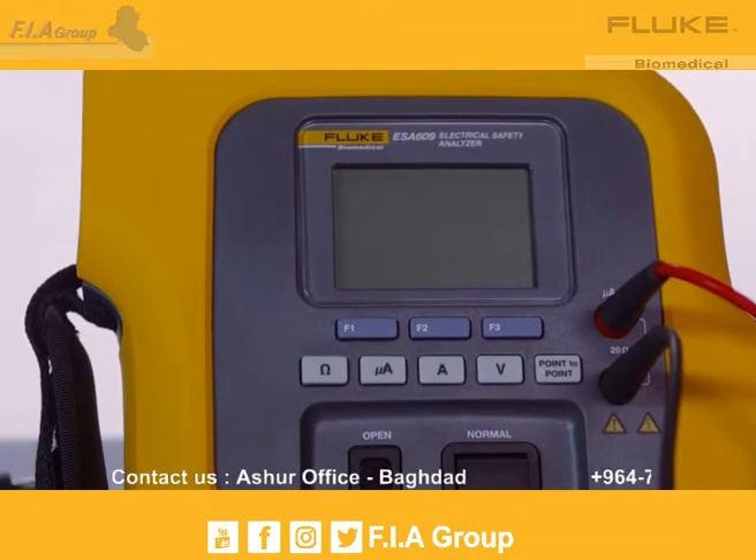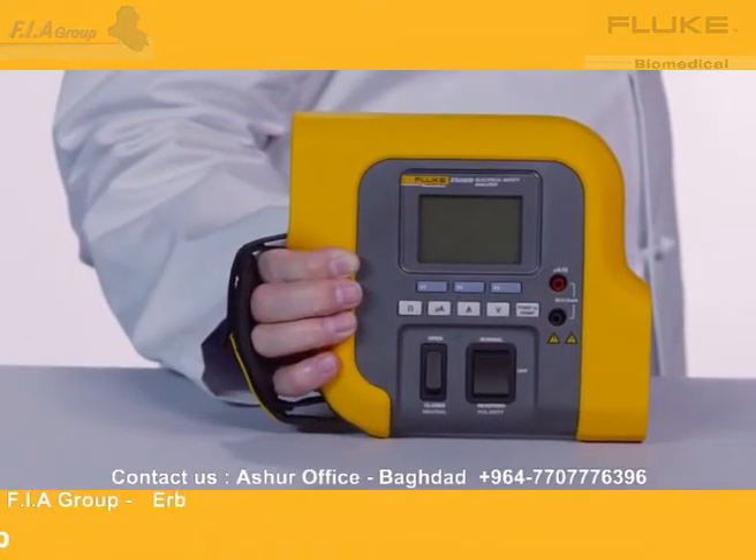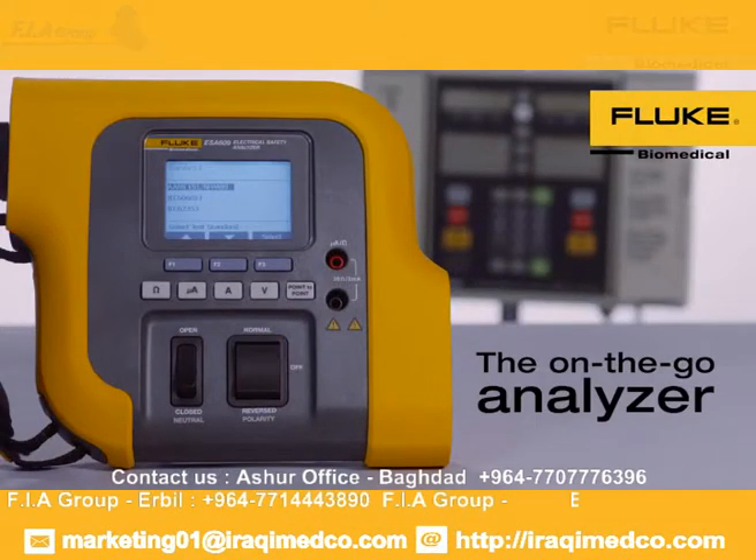The Fluke Biomedical ESA-609 Electrical Safety Analyzer is portable, durable, and easy to use. ESA-609 — the on-the-go analyzer.